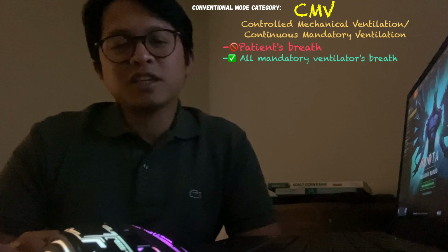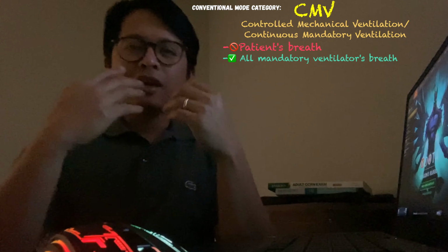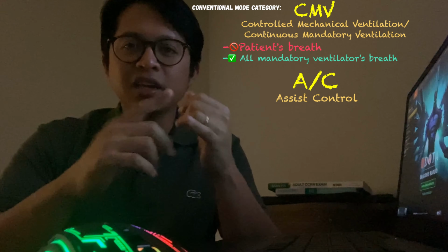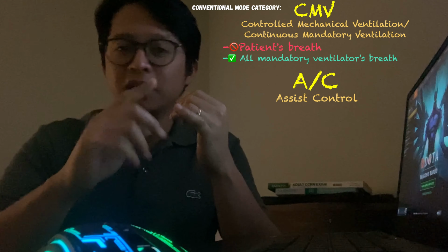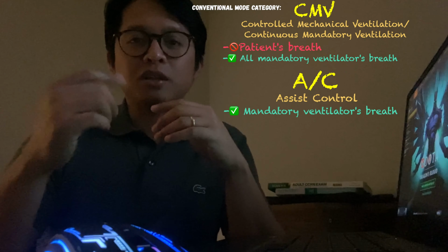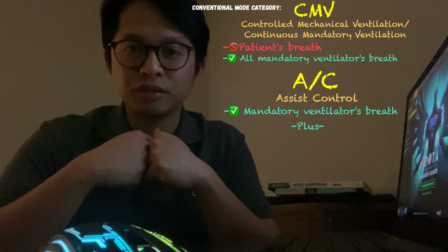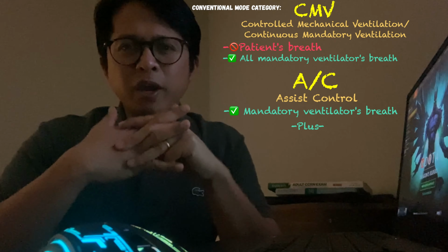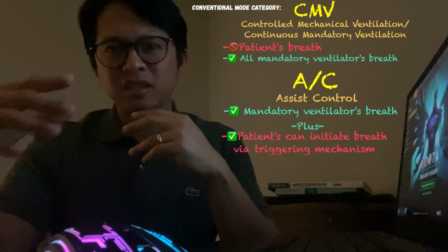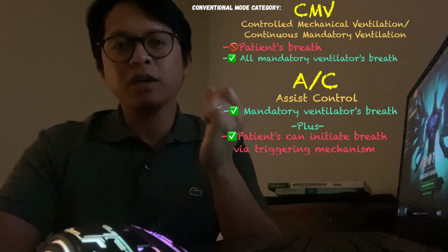Then let's move on to the next one, the AC or the assist control. Here, you also have set parameters like tidal volume and a minimum rate. But the patient is allowed to initiate a breath through the triggering sensitivity. It can be flow triggered or pressure triggered. By the way, all ventilator modes may have the same settings, but some settings are not needed and some are needed by the other modes. Okay, so where are we?